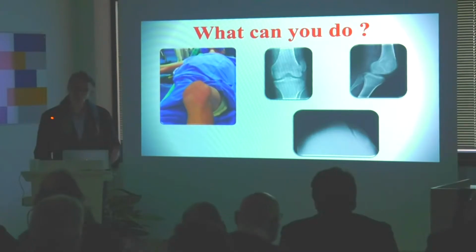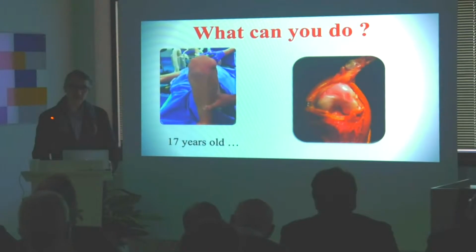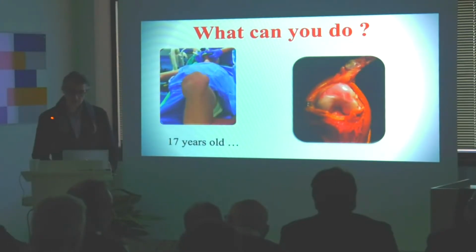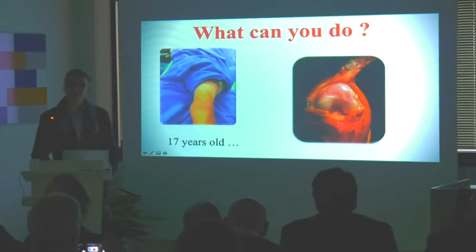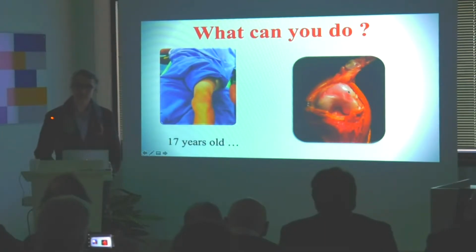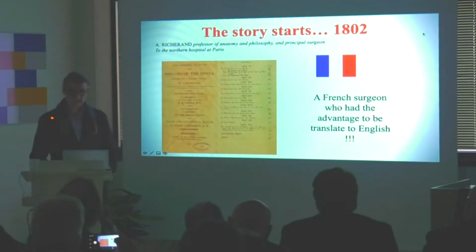And when you know that this patient is 17 years old, and this is his knee, of course, you can do an MPFL. The MPFL will not work too much, of course. And you see that also the cartilage is not really good. Okay. And you have seen that I have opened the extensor mechanism because he had probably a short quadriceps, because he's dislocating in flexion. That's very important.